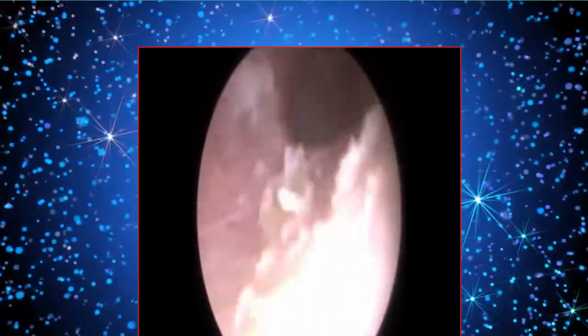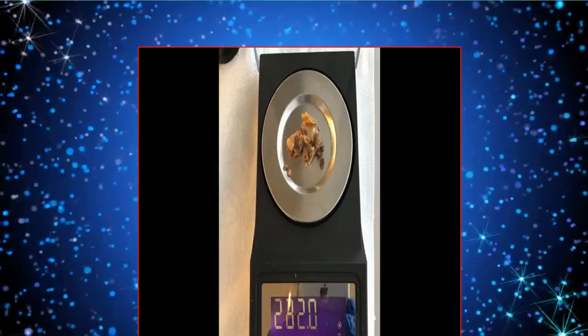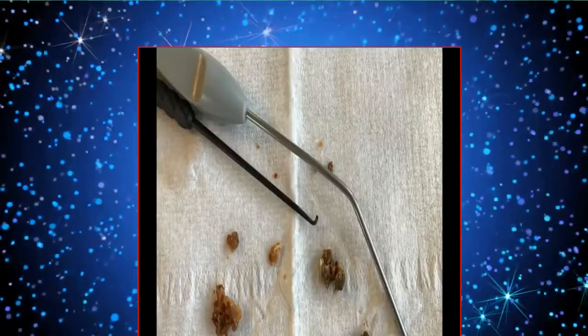This is just a post-examination video of both ears. Just to remind you, I weighed all the wax — it's 565 milligrams — and there are the contents on a piece of paper. I hope you've enjoyed this video.